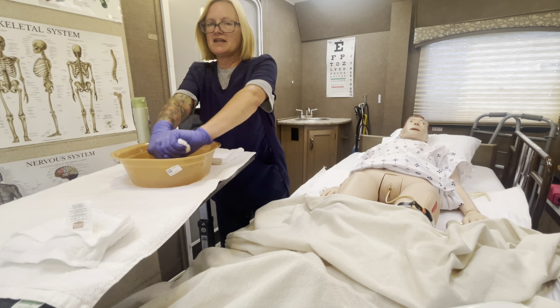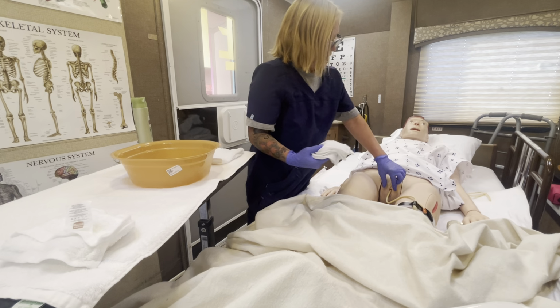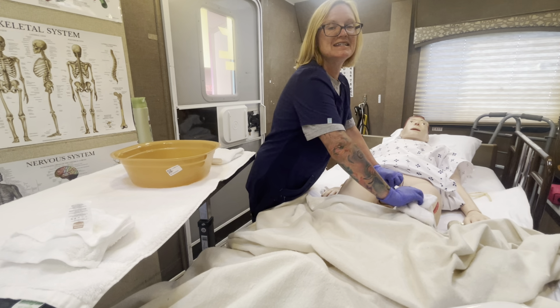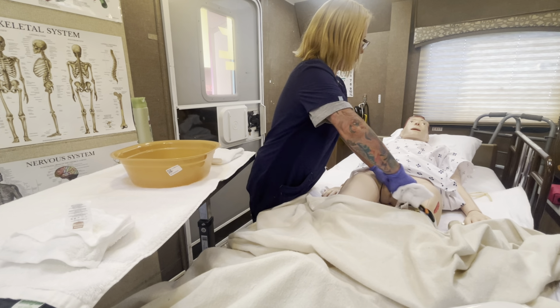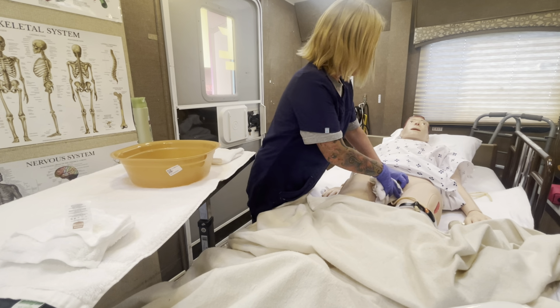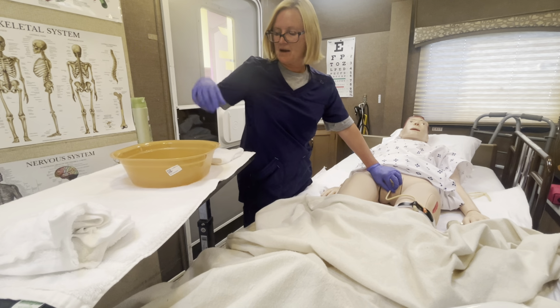Again, I'm going to make sure that I get all the water out as much as possible, and I have my 4 leaves. I'm going to pinch the catheter again and wash down. I'm rinsing the soap that I had off. Now I go to my second leaf, 4 inches down. Go to my third leaf, 4 inches down. Now this is dirty, so I'm placing it on top of that one.